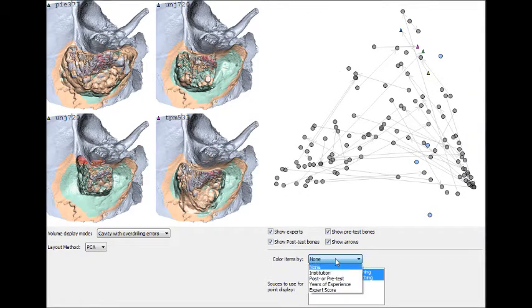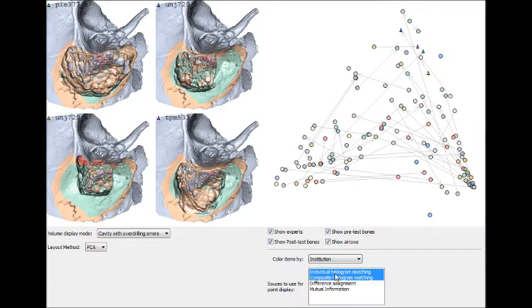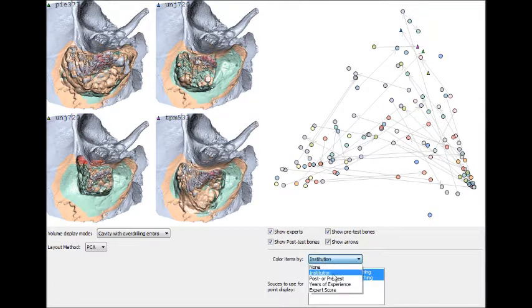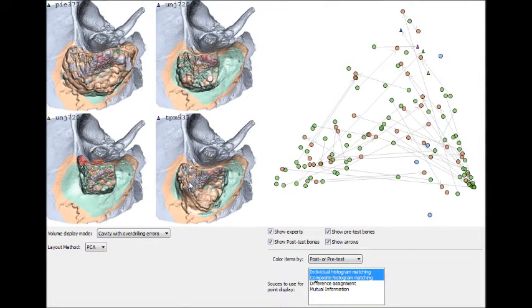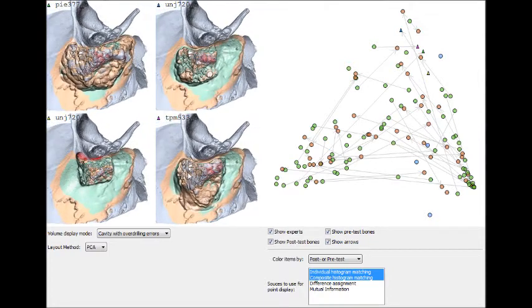Display of volume metadata can be enabled to help give insight to the data set. Here the pre-test items are colored green while the post-test items are colored red.